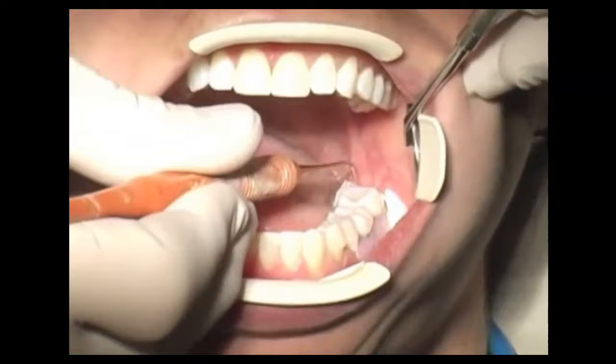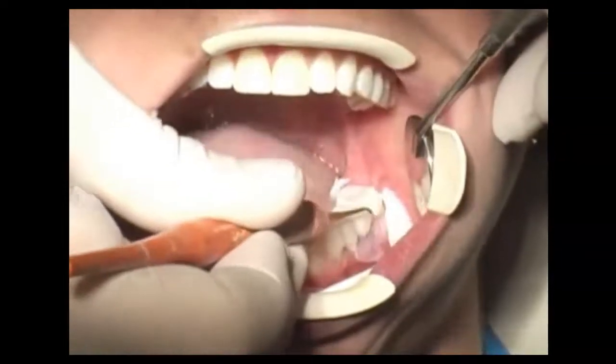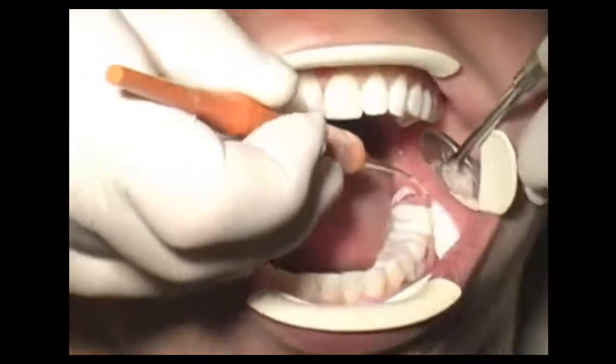So they're just removing all the excess material off of there and then removing the temporary crowns. Sometimes the temporary crowns will come out in the impression, and sometimes they'll stay onto the teeth.